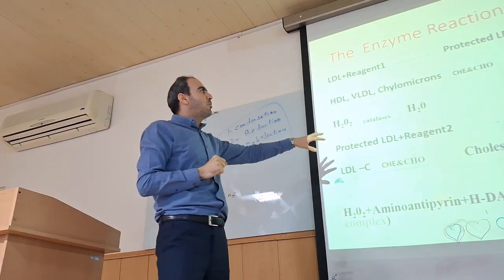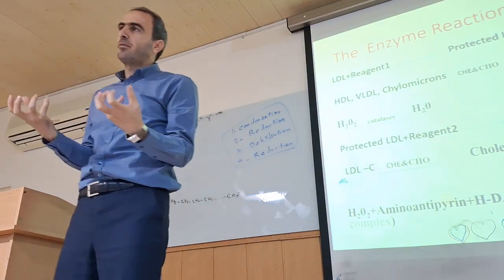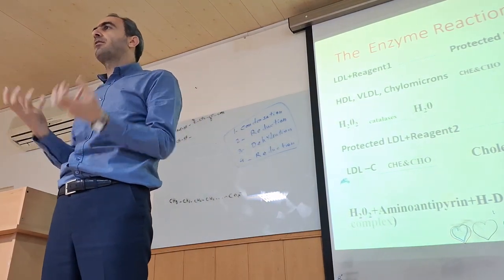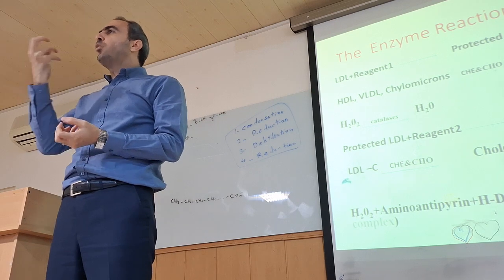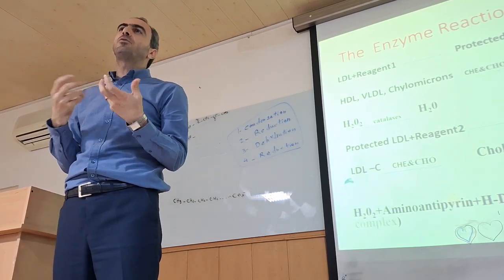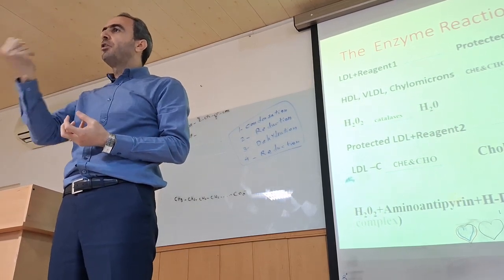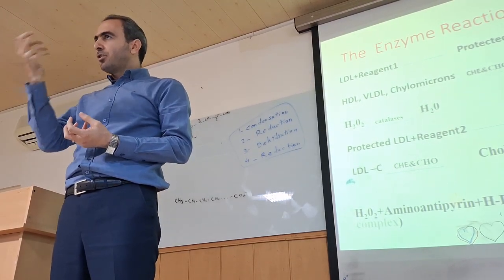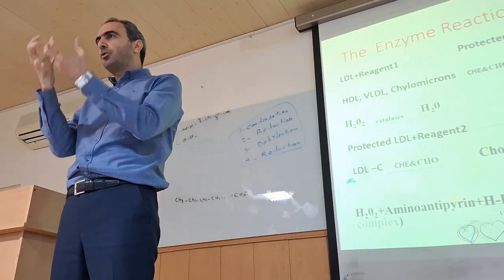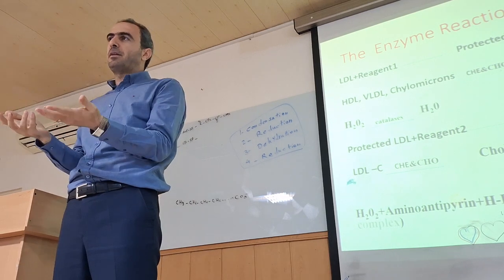For LDL, we have to use the LDL kit. This kit contains some material, some buffers, enzymes. Sometimes we know about the enzyme and buffer. Most of the time we don't know, because they are made by a company and they don't want to release their data. You can just use them as their instruction says, but you don't know what's happening here.